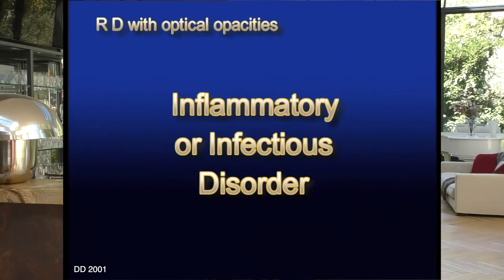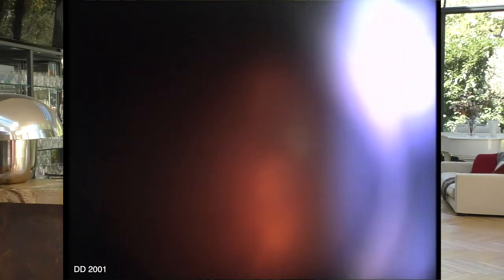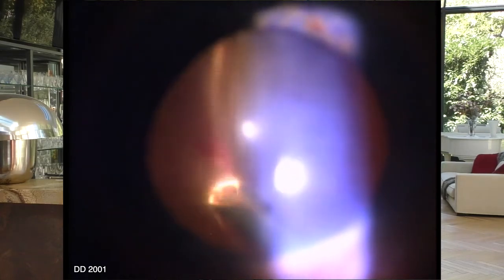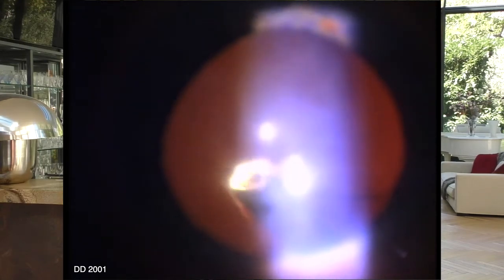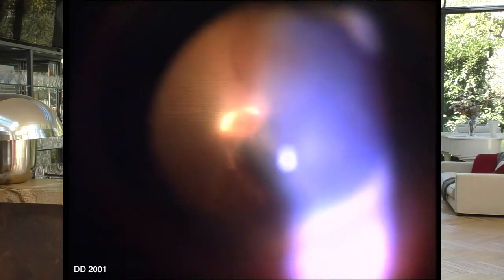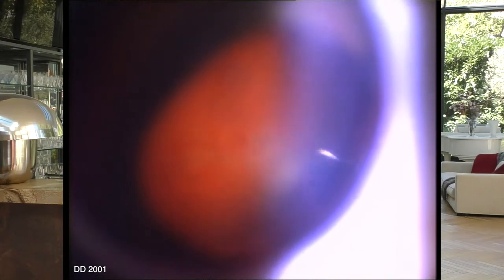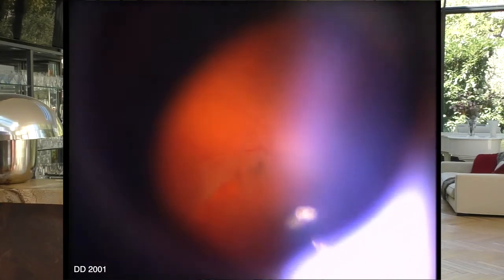With inflammatory or infectious turbidities, the vitrectomy is, in my opinion, much more urgent since the speed and severity of a probable massive retraction or giant tear is so great. The vitrectomy also serves to diagnose the infection and to inject an antibiotic. In this example, where the vitrectomy could have been completed even on the anterior side of the tear, a simple retinopexy gas solved the problem.